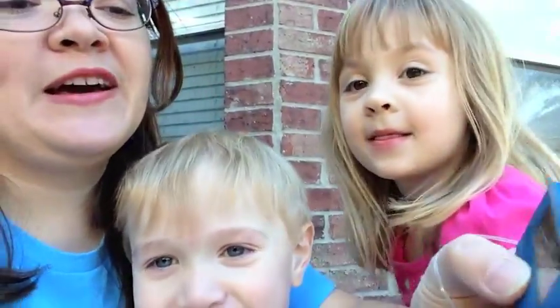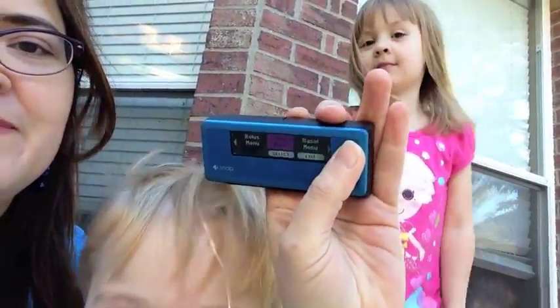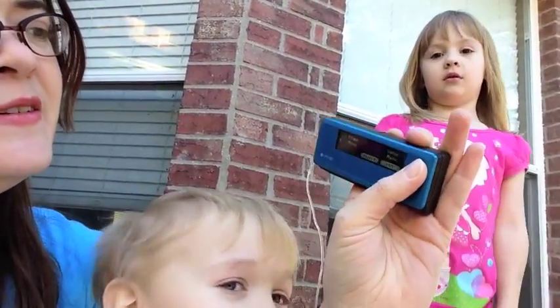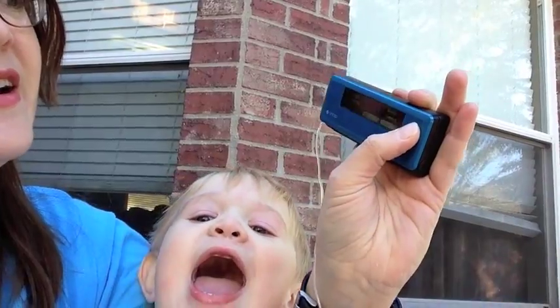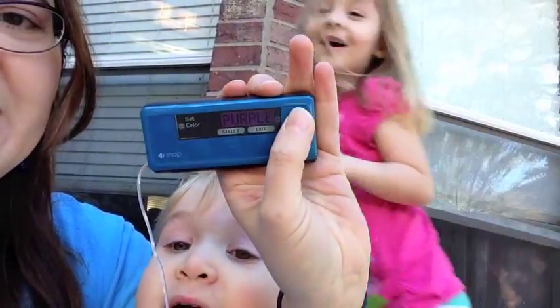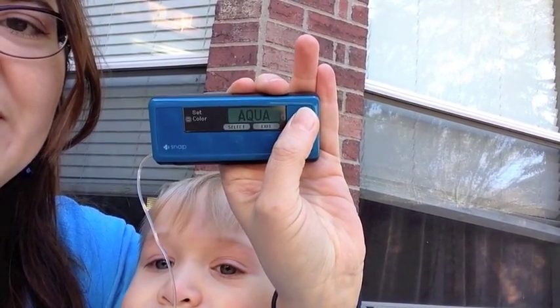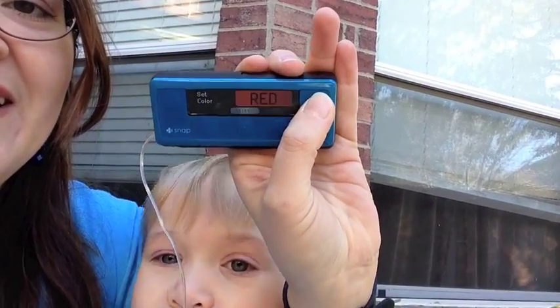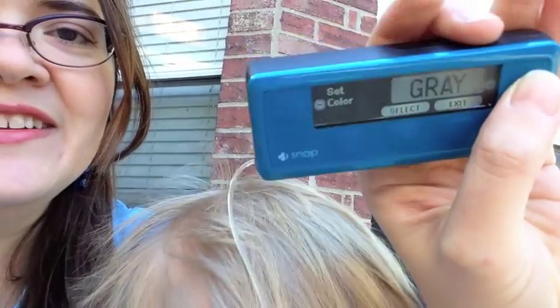Let me show you that color setup that you can do. In the menu, go into the setup menu and go to color. And you can actually choose gray, green, blue, aqua, yellow, red, pink, or purple as your highlight colors.